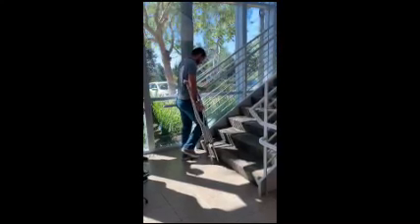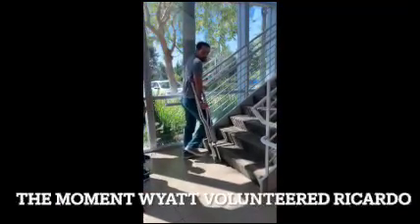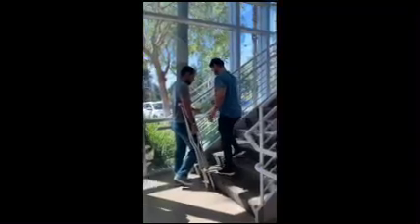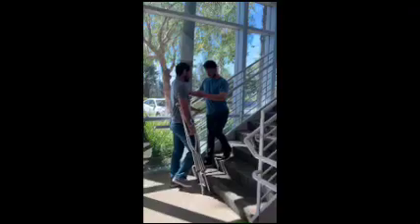Who wants to help me up the stairs? Is this where you want me? Yeah, you want to be behind me. You're always below your patient on the stairs.